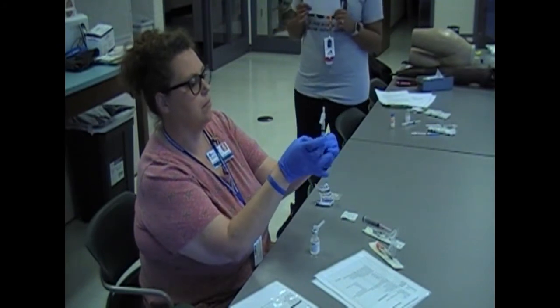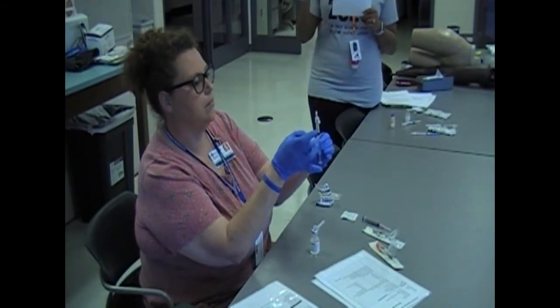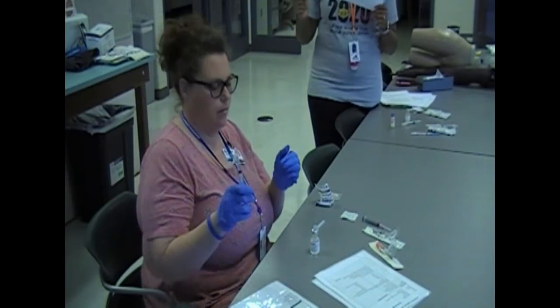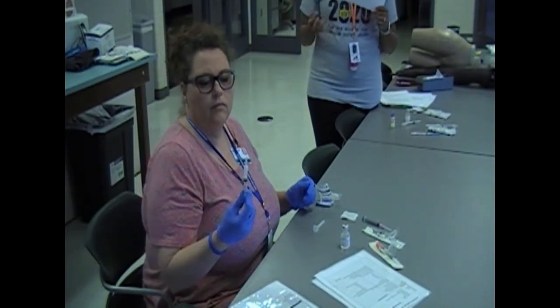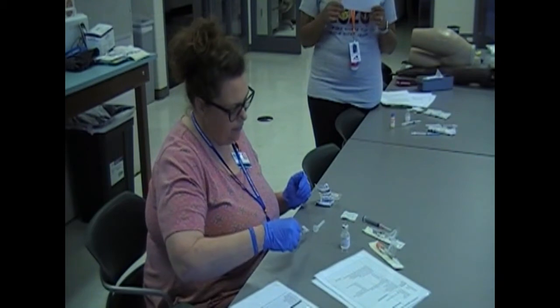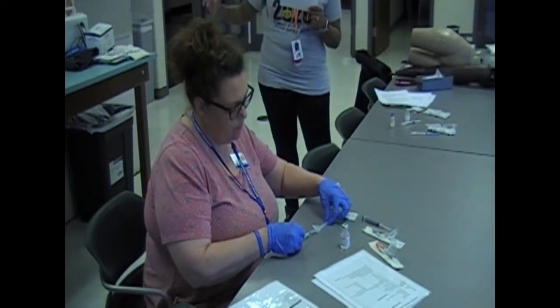To get rid of your air bubbles, you can flick as Miss B is doing. So you flick it with your fingers. You can bang it on the side of your table, whatever you need to do to get your air bubbles out. In the event that you just can't get them out, you must stick your needle back into the vial and start over. Then to recap, you may recap the needle using the 1 scoop method.